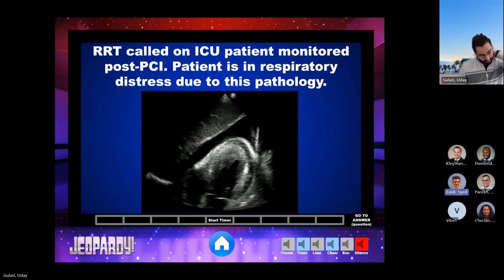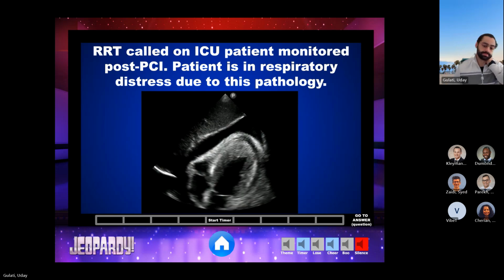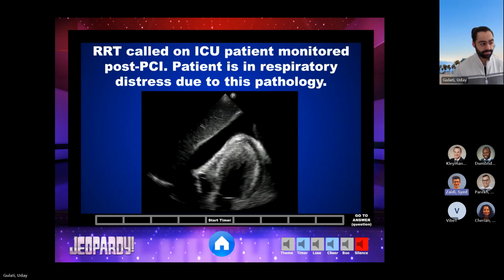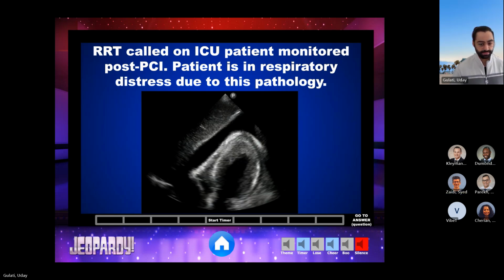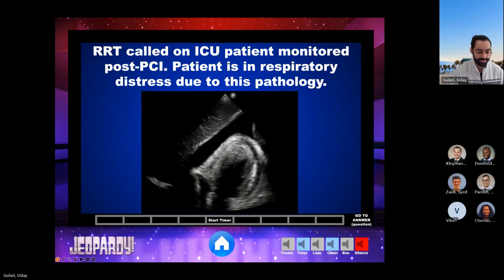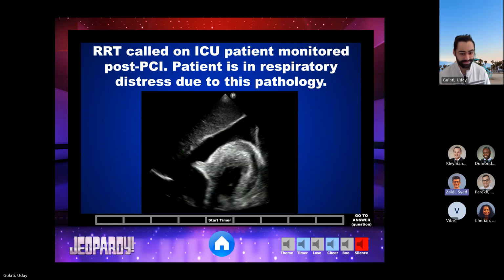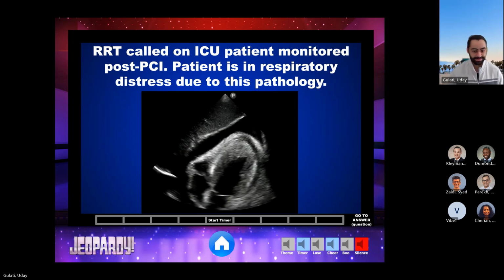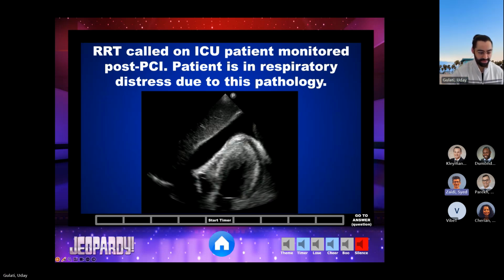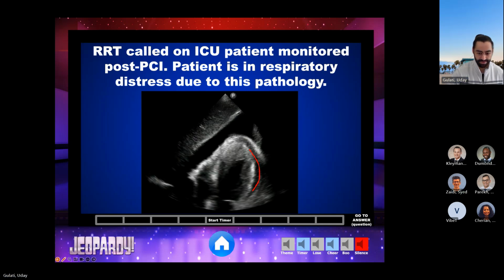I mean, there's a pericardial effusion. Actually, I don't know if it's focal or just concentric. I'm getting a little confused by that tiny circular line around the left side. I don't know if that's just a fat pad or what's going on there. You're talking about around the heart? Yeah, there. What do you think that could be?